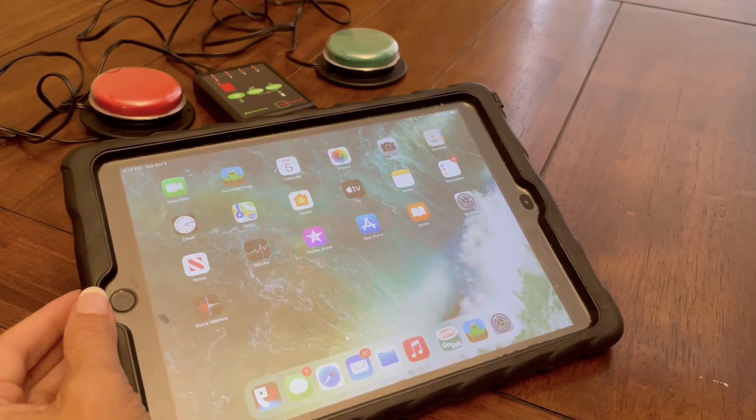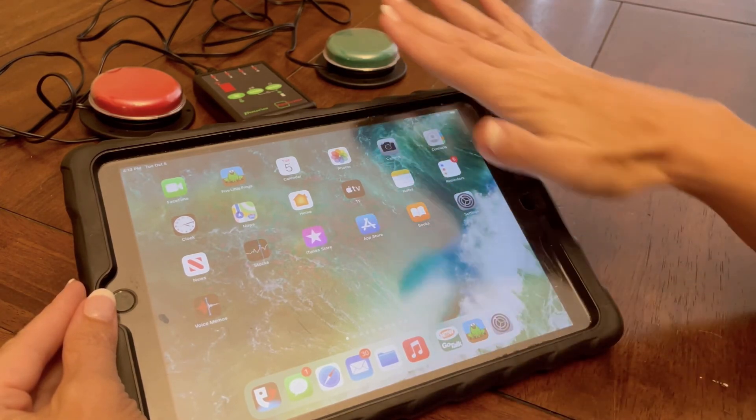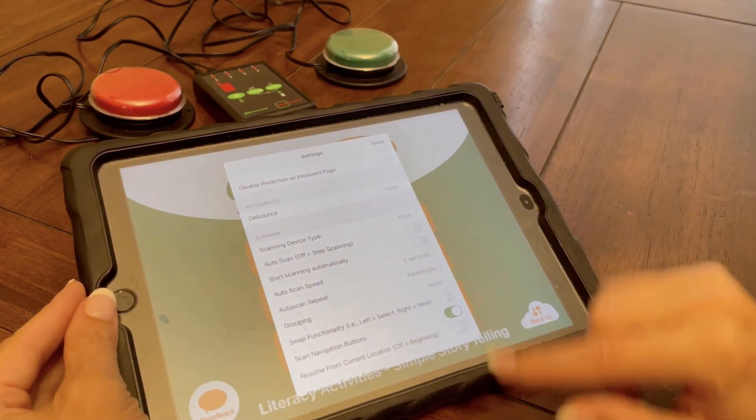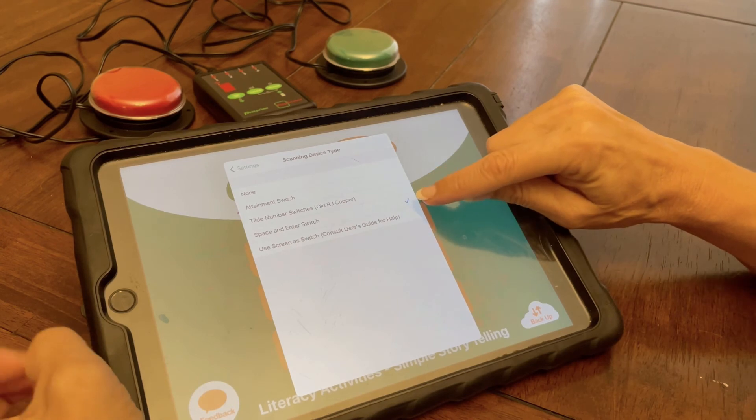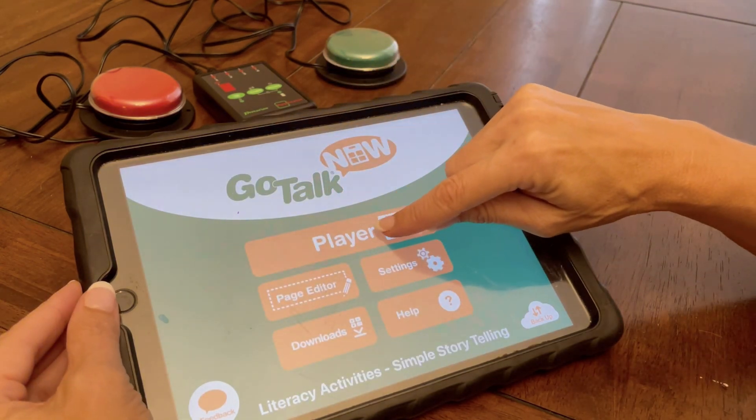When doing switch access to iPad applications that have embedded scanning, you will just pair the iPad, go into the application, tell it that you're using space and enter, and it'll automatically be compatible.